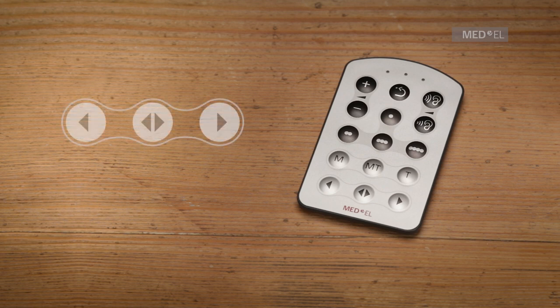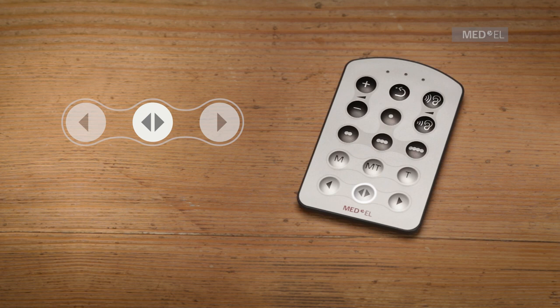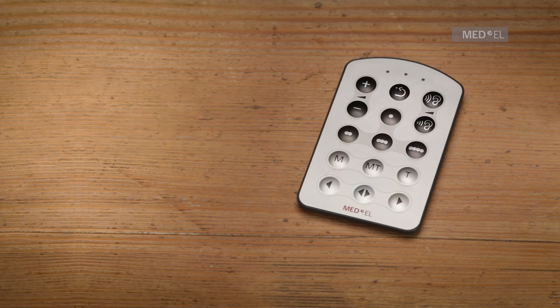Then hold it down for more than five seconds to enter the program mode. Press the left arrow key to deactivate the keyboard lock.